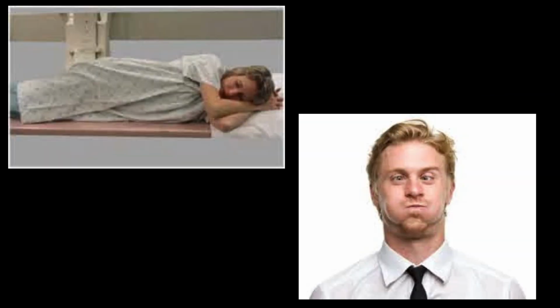I am also going to review some scanning techniques for scanning the right upper quadrant. Rolling your patient may help slightly move the organs or gas for a better image. A common position is LLD, which is when the patient rolls on their left side. Another technique is having the patient take a deep breath and hold. This will also help slightly move the organs to image them better.